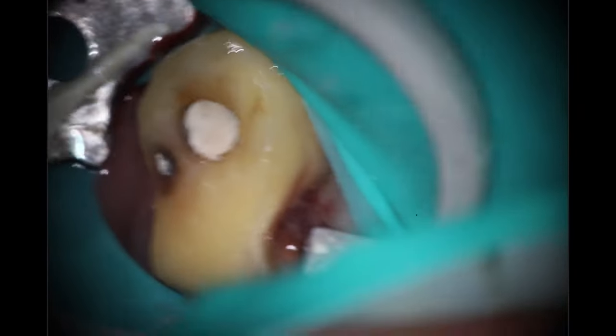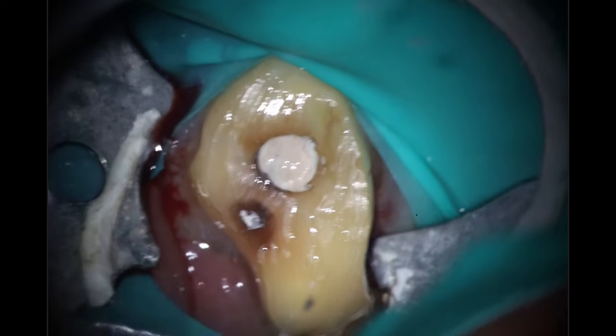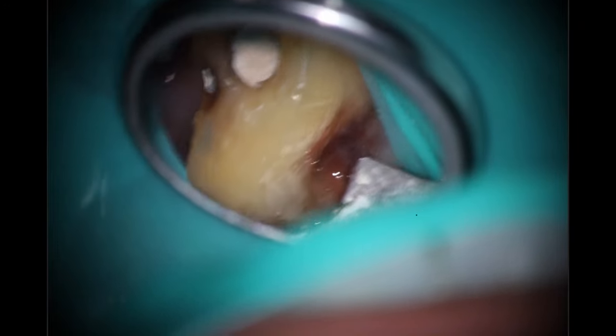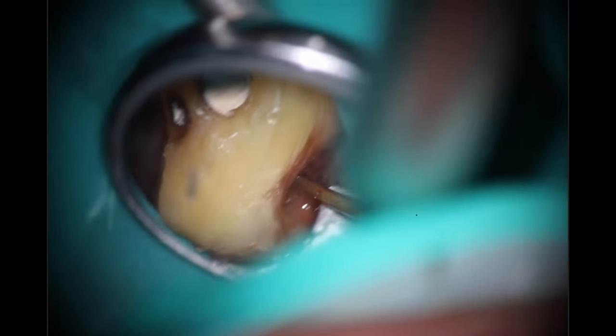I've used butterfly clamps on molars before in cases like this where it's completely broken down. And with that rotation, you're slamming into that implant if you're going to try to get it along where the traditional buccal and palatal would be. You can see on the palatal the clamp is actually going into where the decay is. So I'm trying to figure out how we're going to be able to do this the most effectively, and I elected to go for a dual access approach here.